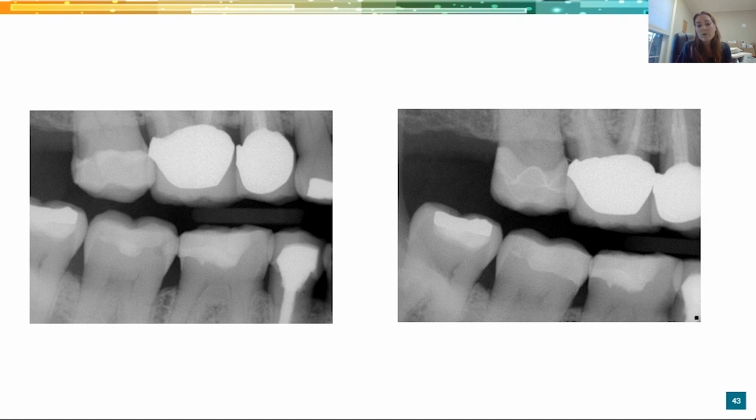I am very close to the bone. I'm aware of that. With this patient, we did go over possibly needing to do a little crown lengthening in that area. What is also really cool about CEREC is when you do that buildup and you're milling your crown, you can go back into that area and remove whatever bone you need instead of sending this patient to a specialist, having it done, and waiting 6 to 8 weeks to come back. You're cutting months off of treatment, whereas you can just go in, build that margin up, and see how the patient feels afterward.